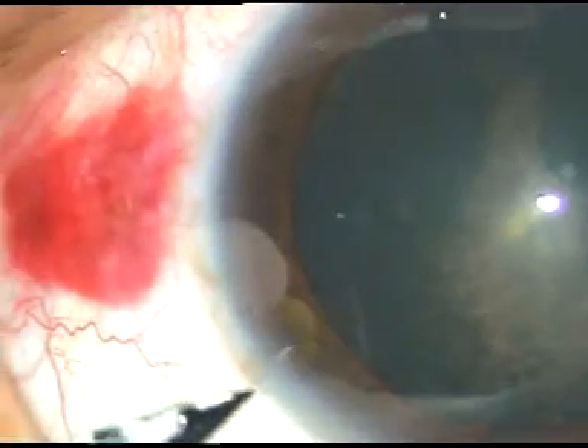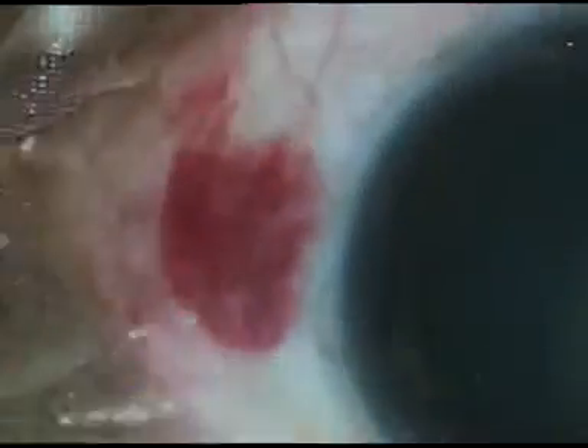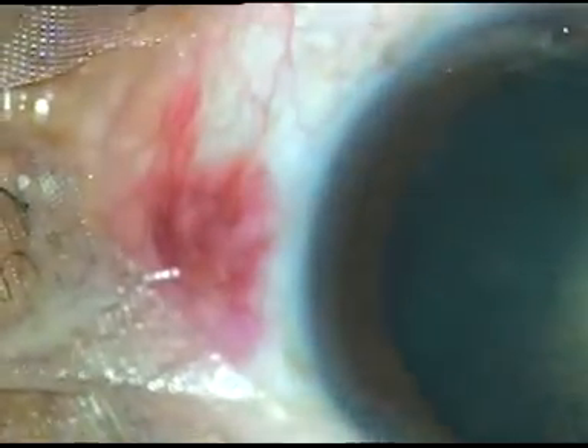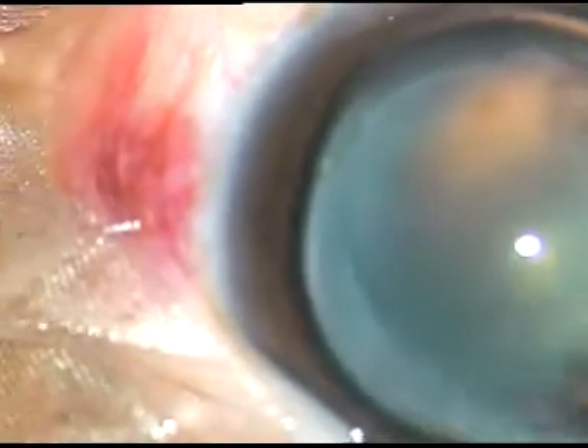The main incision has been made. One side port on the right side of the main incision and another side port on the left side of the main incision. Viscoelastic substance, if we apply over the corneal epithelium, there is protection of corneal epithelium as well as it improves visibility. So here is HPMC over the corneal epithelium.